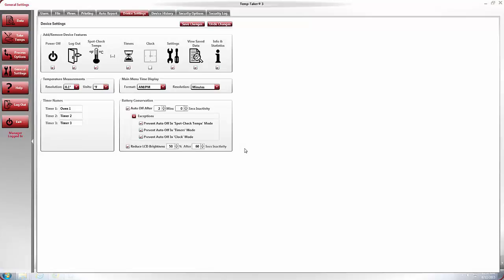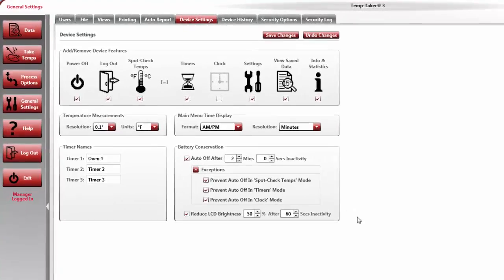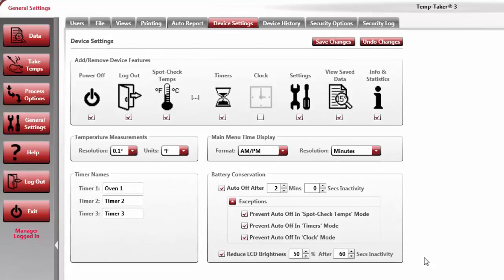Welcome to the Temptaker 3 video training series. This video explains the Device Settings tab, located within the General Settings section of the software. The Device Settings tab is where you go to customize specific settings within the Temptaker handheld unit.